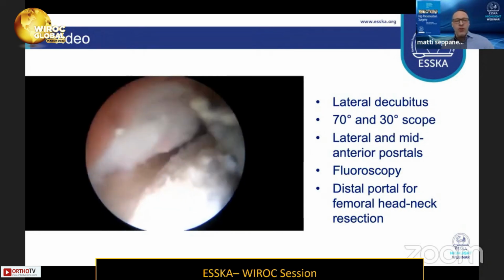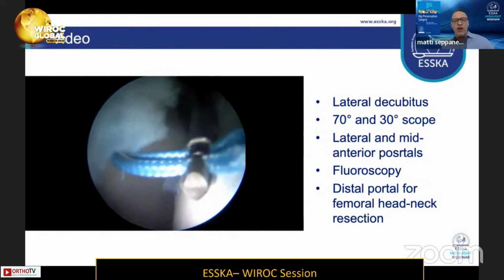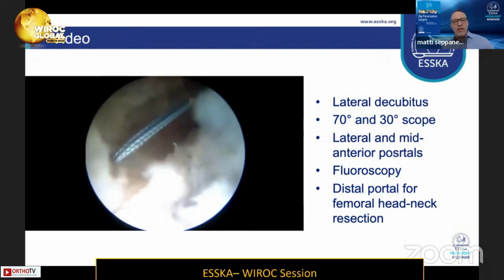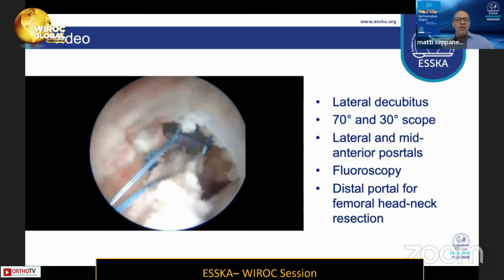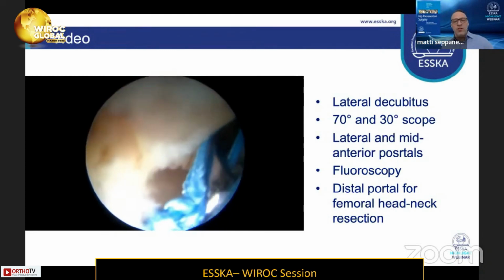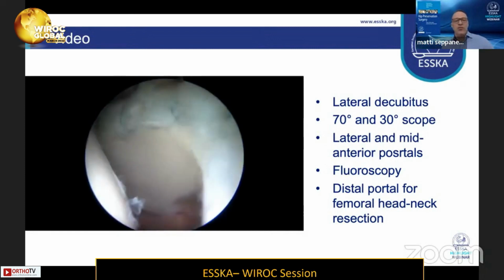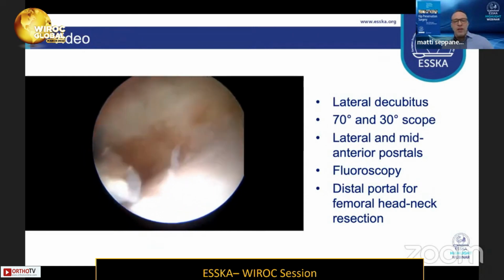Here we put all suture anchors to the acetabulum. The benefits of all suture anchors are that you can put those quite near to your joint cartilage, so you don't retract labrum too much. I like to use these suture instruments because you don't pierce too much your labrum. It's very effective to manage the tightness of those sutures, and usually 4 to 5 anchors are enough if you do very deep acetabulum resection.